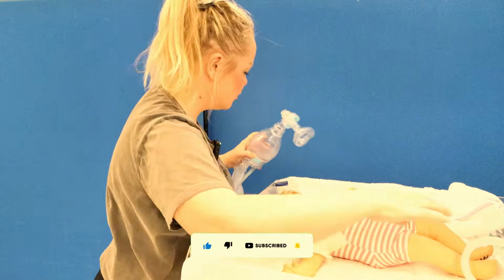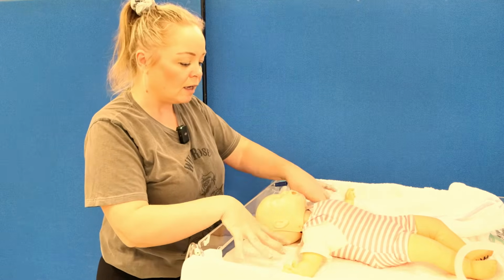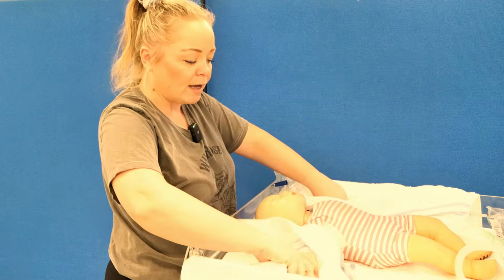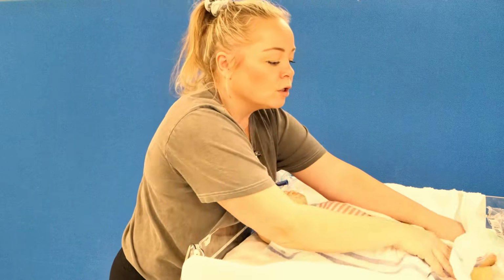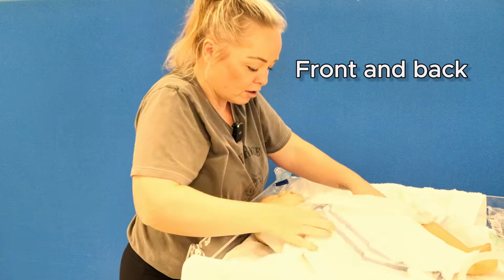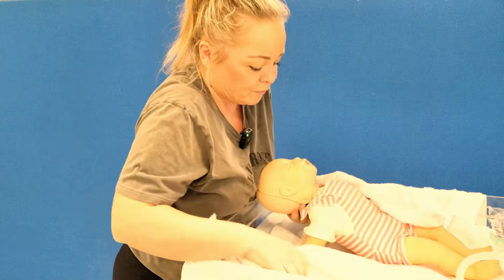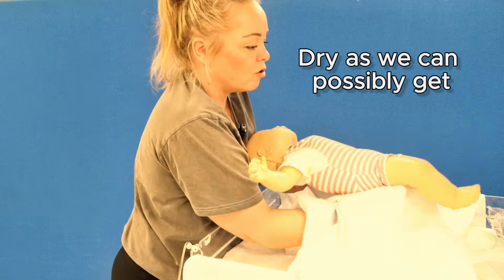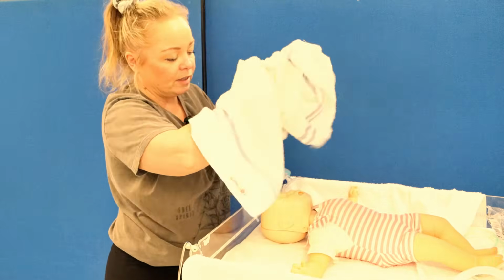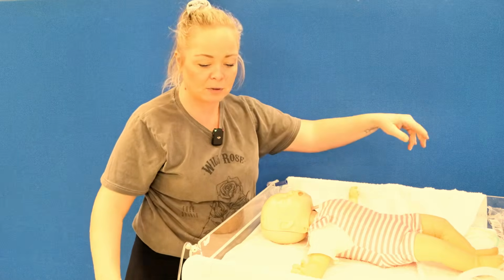So, baby has just been born in poor condition, placed onto the resuscitator. Our first priority is to dry and stimulate. Babies come out, they're wet, they're cold, so we're going to do some really good vigorous drying, front and back, minding the head, being really gentle, making sure that all the area is as dry as we can possibly get. Ensure you pop the towel in a place where it's not going to be a danger to someone, so underneath the resuscitator or in a bin.